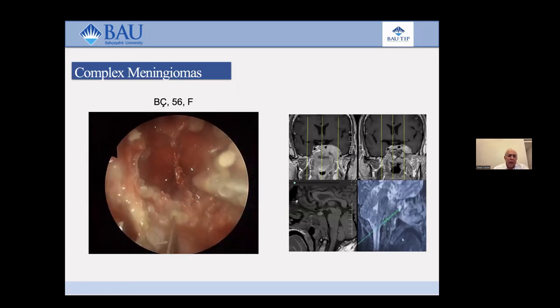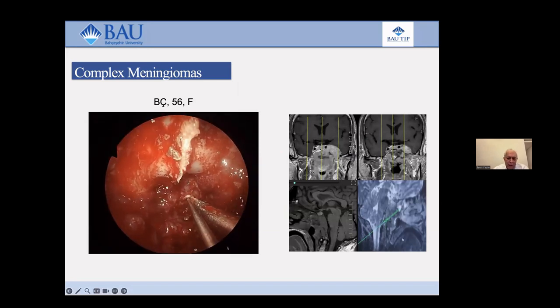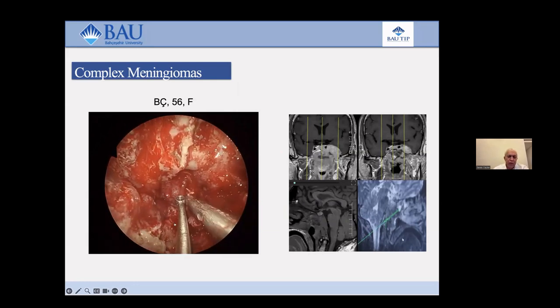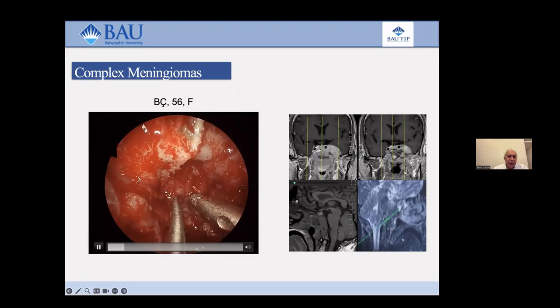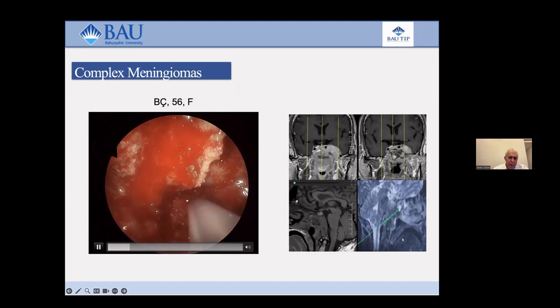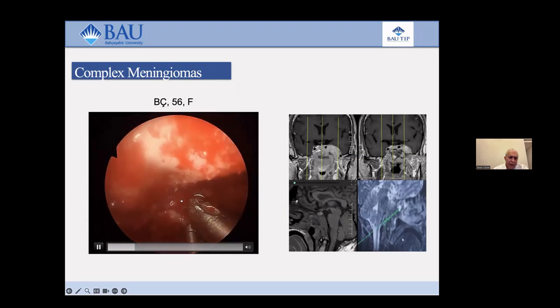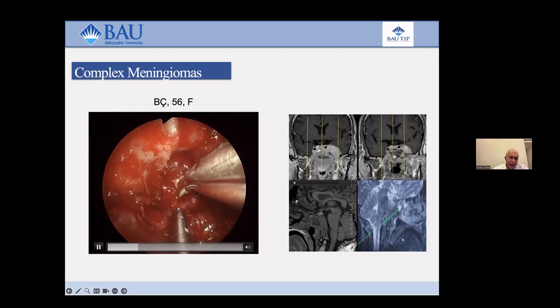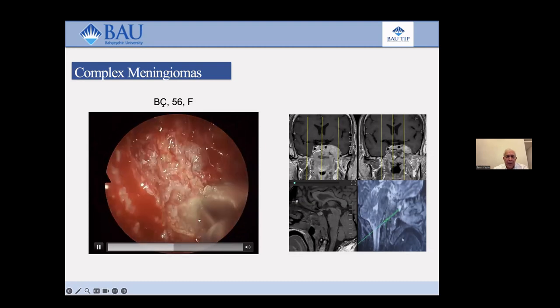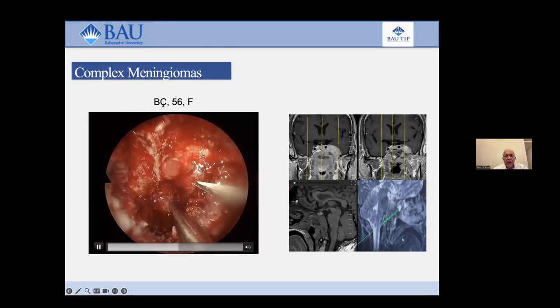The other complex tumor, this case is one of the last cases. The tumor extends to the sphenoid sinus, cavernous sinus, and craniocervical junction and odontoid tip inferiorly. Firstly, the tumor involving the sphenoid sinus was resected. At this stage, we perform extradural dissection and resection, and this tumor was resected. And then in the second stage, in this case, we open the cavernous sinus.